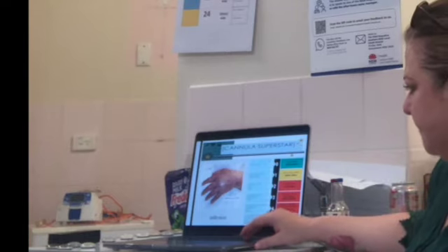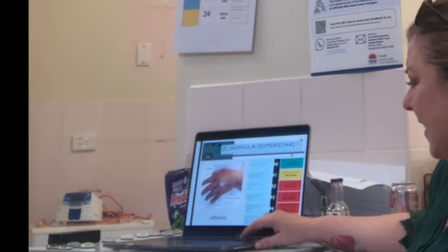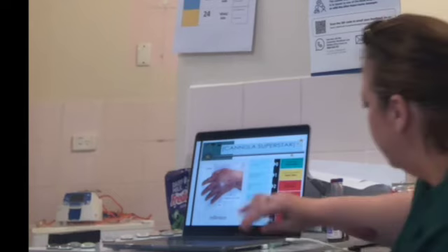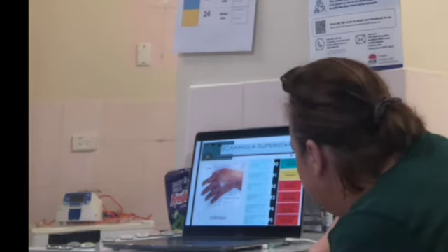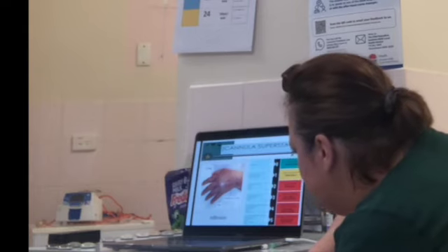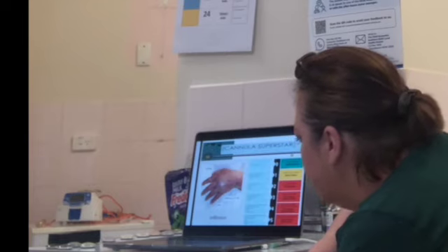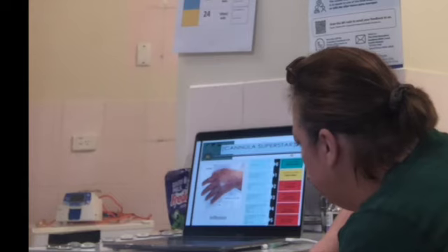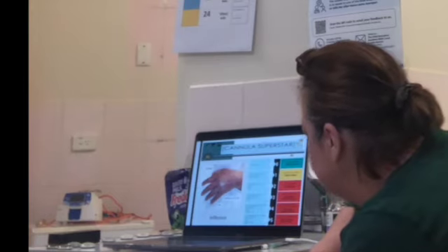So if we identify redness at the IV site, obvious swelling, and I reckon that's pretty painful. What do you reckon we give it? She's complaining of pain. A 4. Can we give it a 4? So pain on the path of the cannula, redness around the site, swelling, and a palpable venous cord. So for a 4, it has to have all of those following signs.